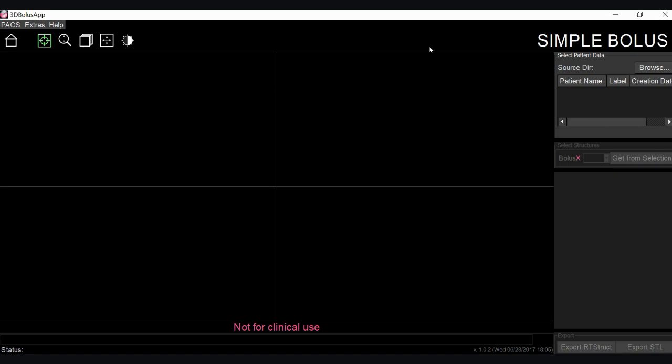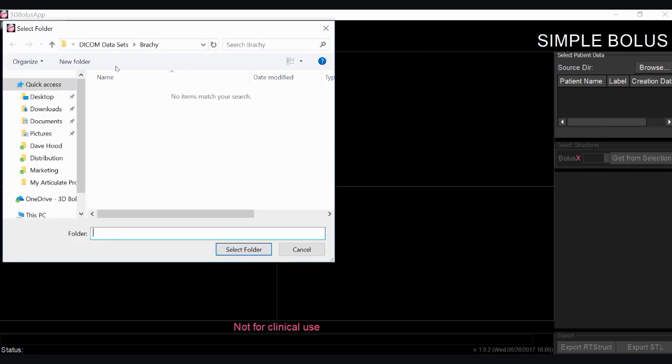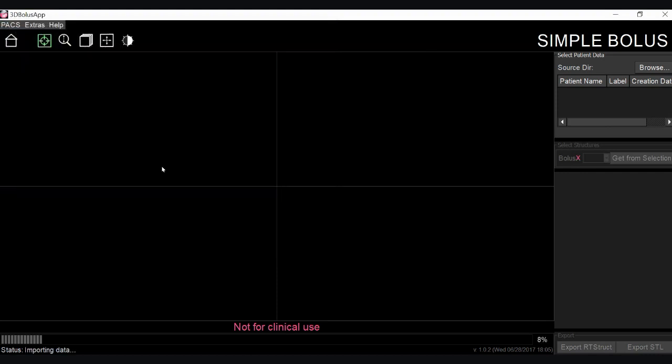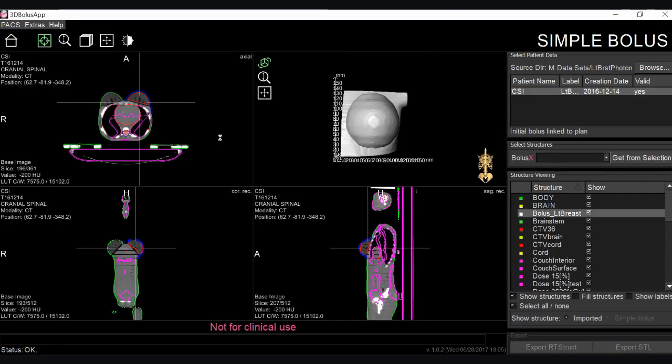The input into our simple bolus module is the CT scan information as well as the structure set information that comes from the treatment planning system.